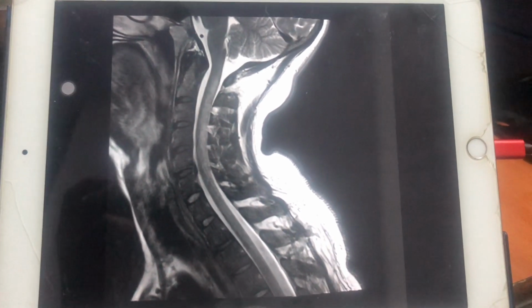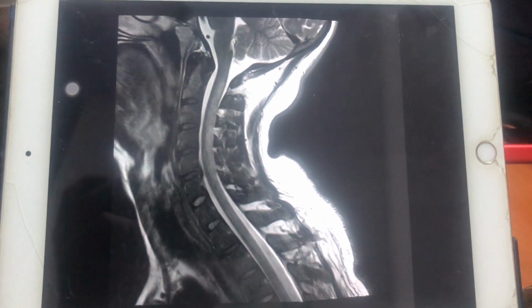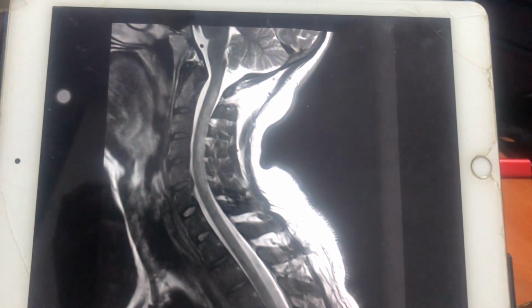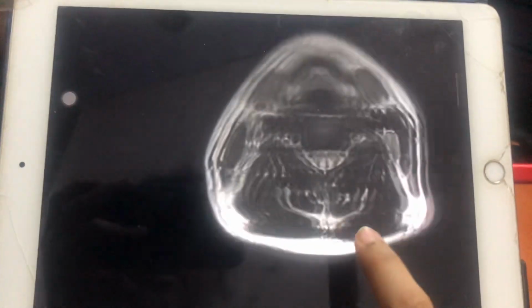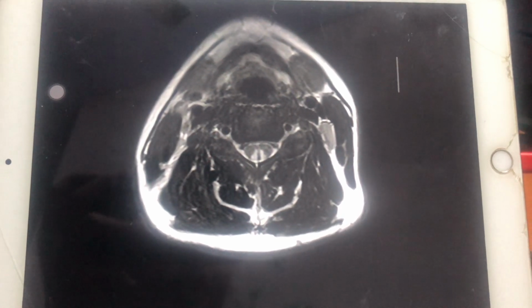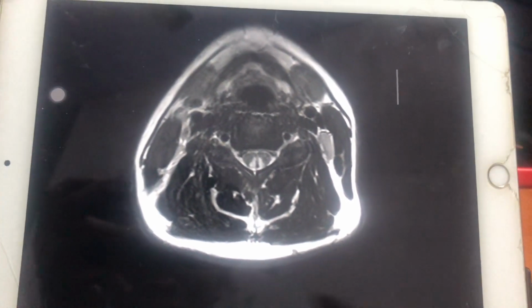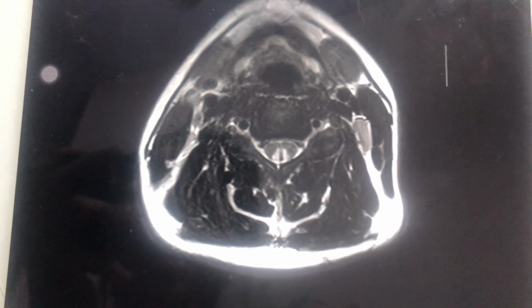Next we come to SACD, subacute combined degeneration of the spinal cord. I don't have much to say about it except the pattern of involvement. About 60 to 85% of patients with SACD have normal spinal MRs. If the spine is involved, then again it is an inverted V-shaped kind of involvement involving the dorsal cord. Very rarely the anterior cord may also be involved. Okay, so it is the kind of pattern of involvement that helps us clinch the diagnosis.